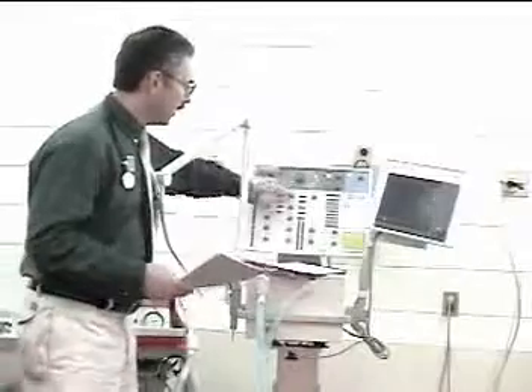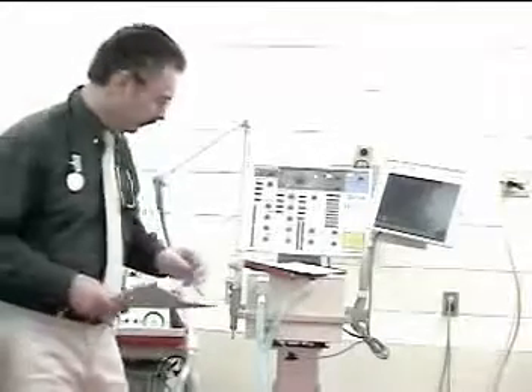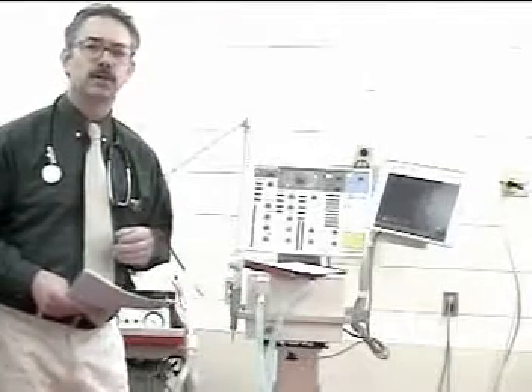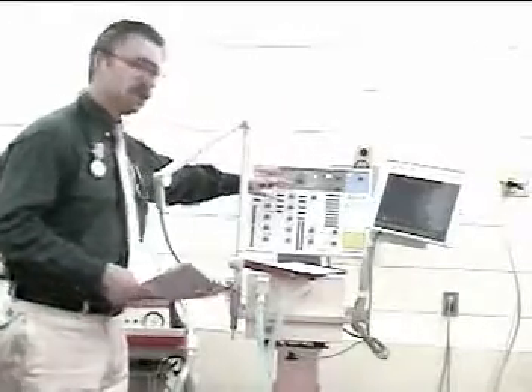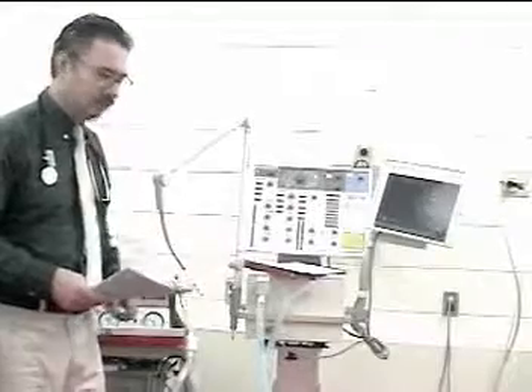We're also going to check the tidal volume. In our charting we record two types: the ordered tidal volume and the corrected tidal volume. As the tubing expands, we lose volume that does not reach the patient, so we correct the tidal volume to ensure the ordered volume actually reaches the patient's lungs.